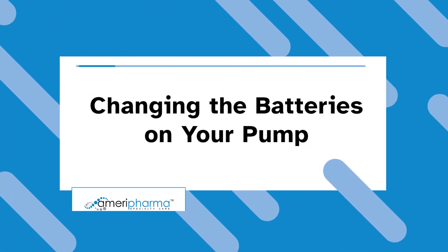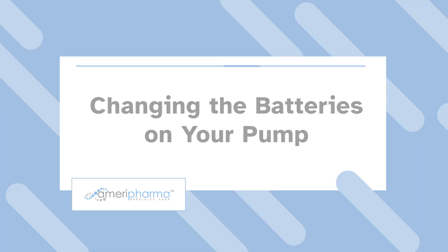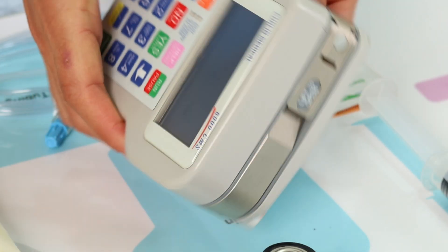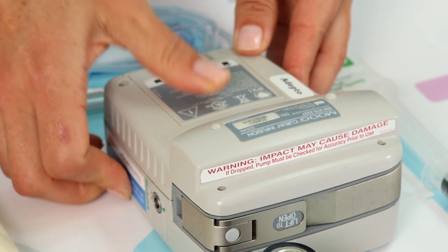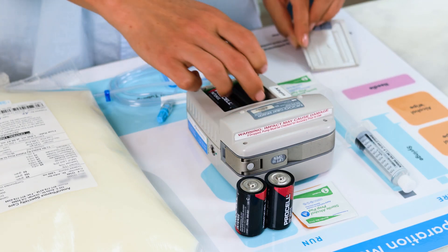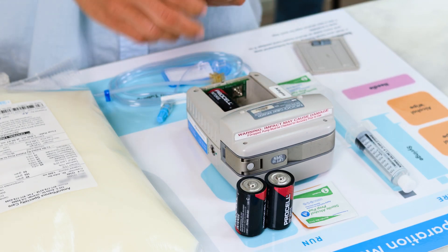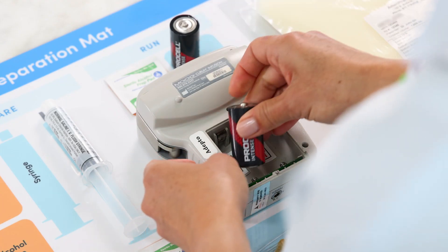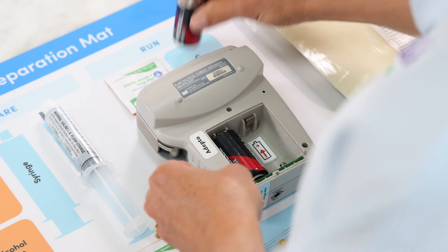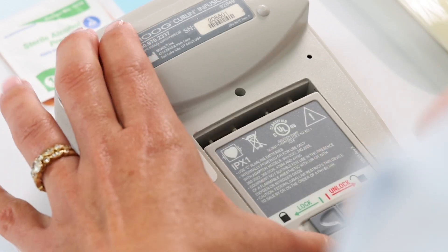To change the batteries on the pump, locate the battery cover on the back of the pump. Open the cover by sliding the bar right to the unlock position. Remove the battery cover by sliding it downward. Insert the two new C batteries so that they are in the same upright position. Slide the cover back on the pump and lock it by sliding the gray bar to the left lock position.